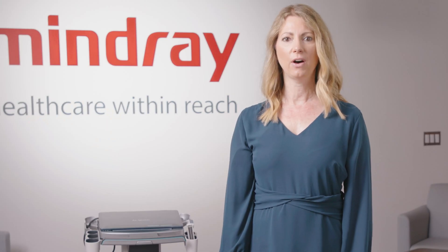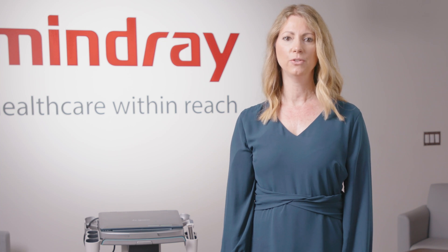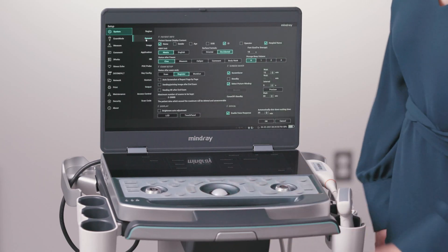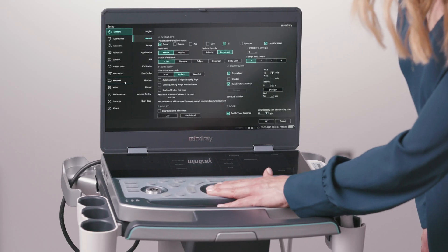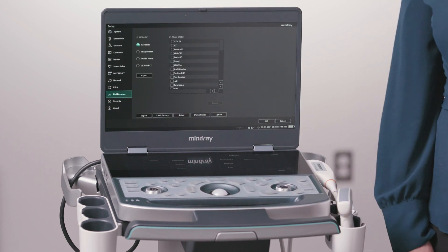Monitor brightness and contrast are important factors affecting image quality. The factory default setting is ideal, but if you need to adjust due to variability in room lighting or user preference, Setup > System > General is where you would go to make these adjustments under Display. To save a copy of the user and system setup data, go to Maintenance and export to a memory device such as a USB or external hard drive.